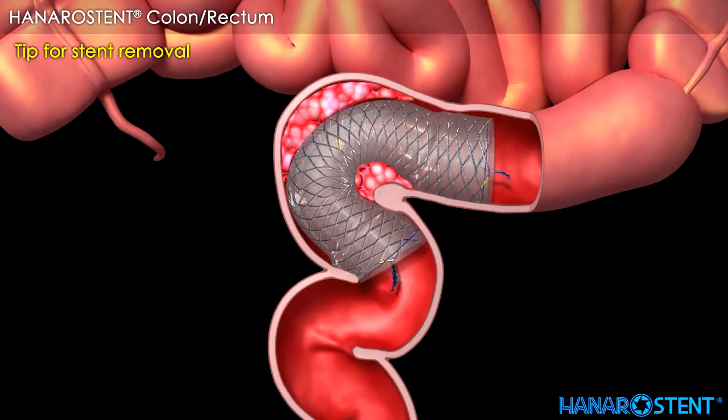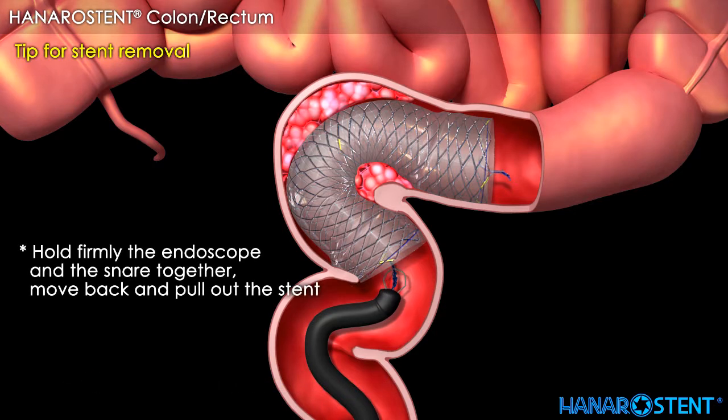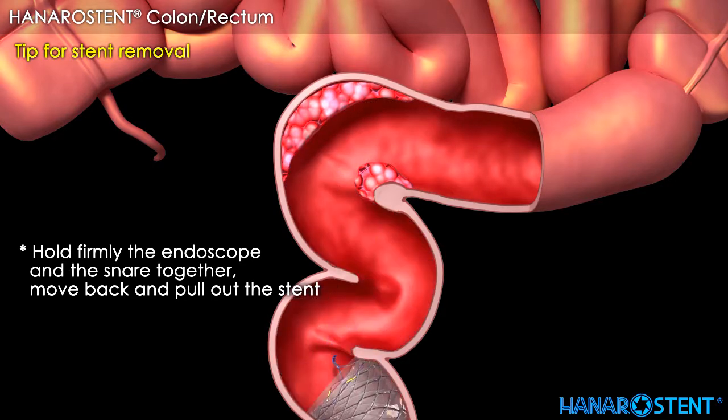Here are tips for stent removal. Use a snare. First, close the stent by catching and pulling the lasso. Second, pull the snare inside the working channel. Third, hold the endoscope and snare firmly together. Then move back and pull out the stent.